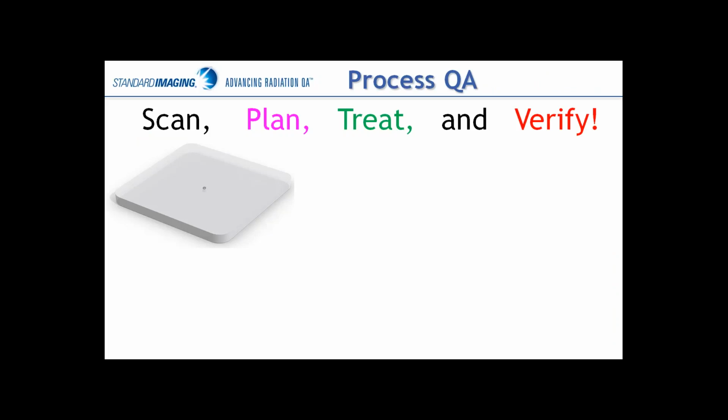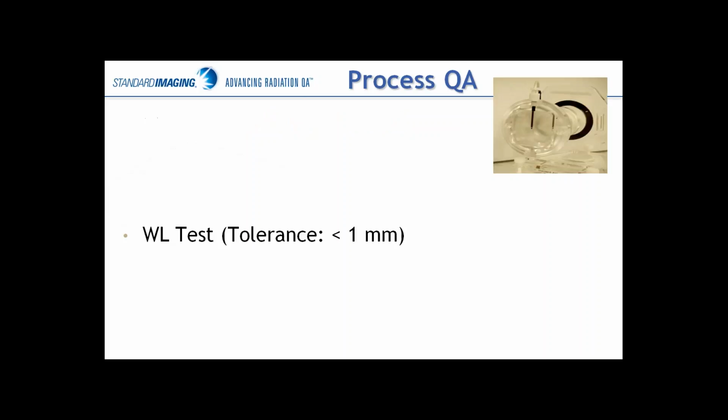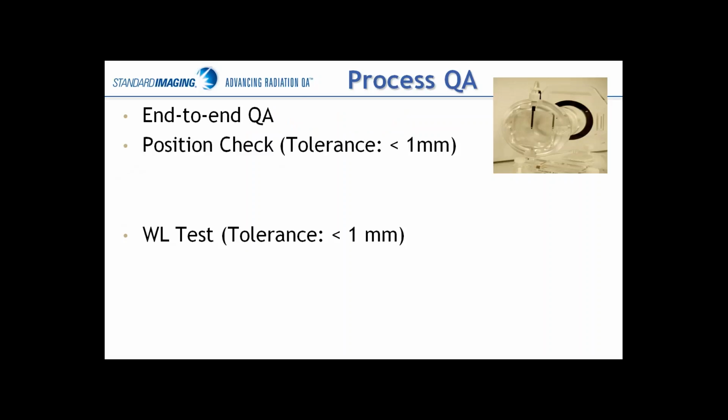values. The Winston-Lutz type test is another method to test this whole process, whereby we've got a hidden target shown by this small BB insert here. And that's imaged, that's planned on, and then that's delivered using your treatment planning system and daily image verification and a measurement at the end, giving us a true end-to-end style test of your SRS QA process. And this is above and beyond testing each one of those steps.